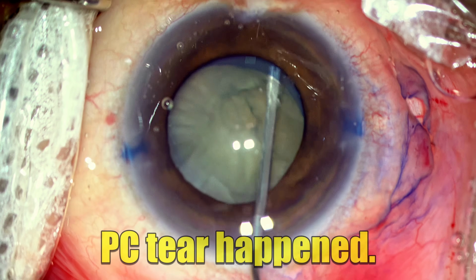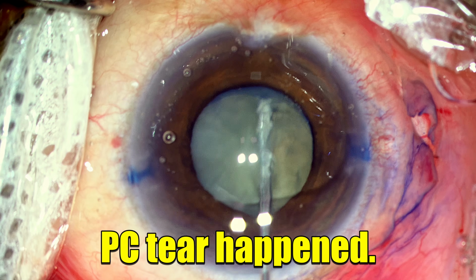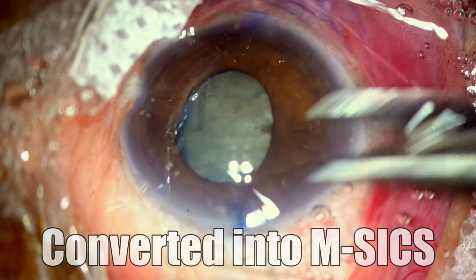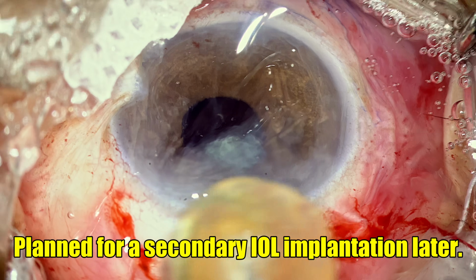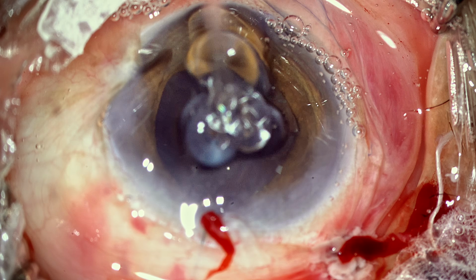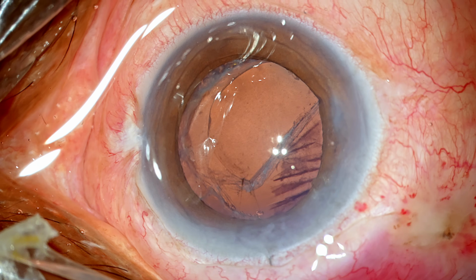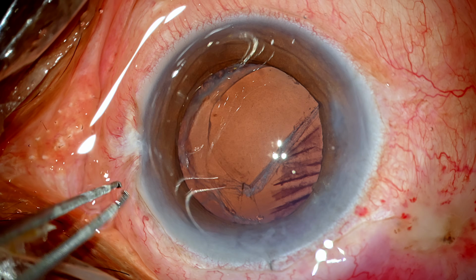So the moral of the story: if you have a difficult situation intraoperatively, it's perfectly fine to just get the nucleus out and maybe plan a secondary lens later on. If the surgeon is overwhelmed during the primary surgery, the decision making can become a little bit difficult, but in such situations, it's okay to wait for maybe a couple of weeks when things become a little bit calm and you can think better.